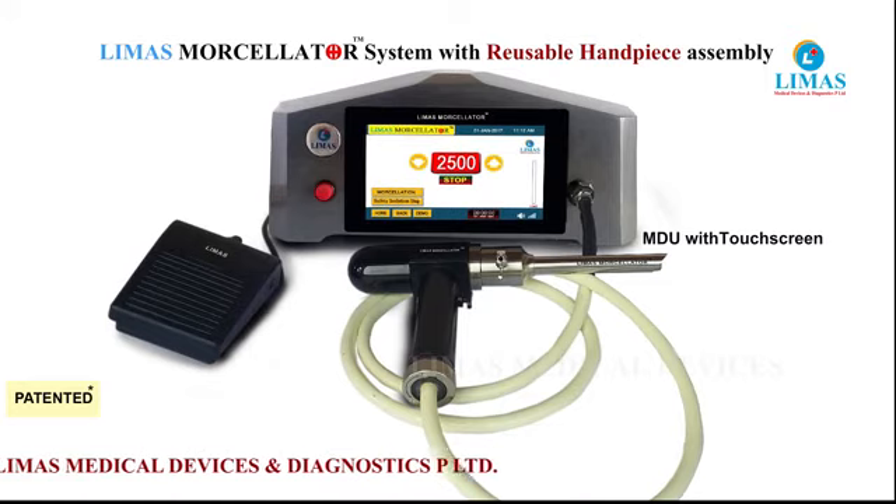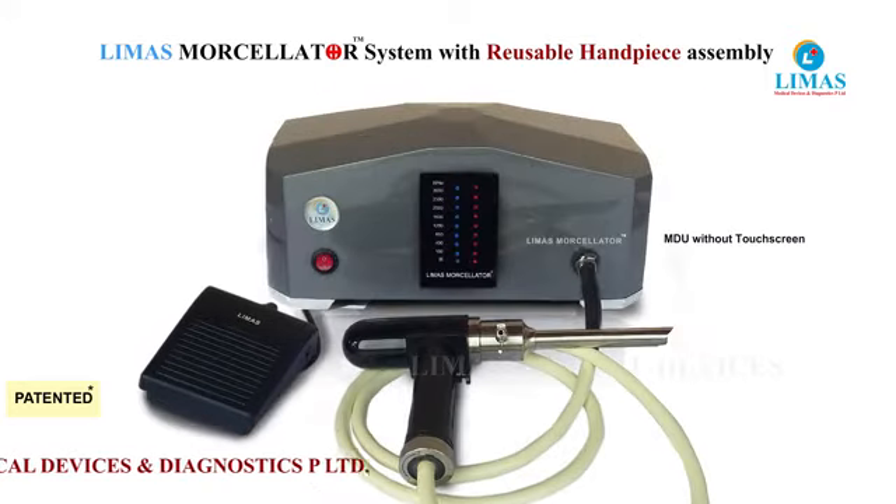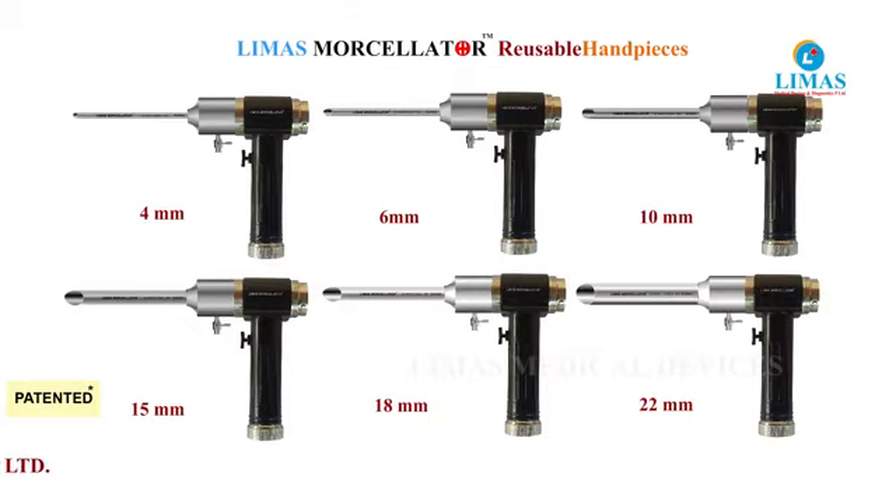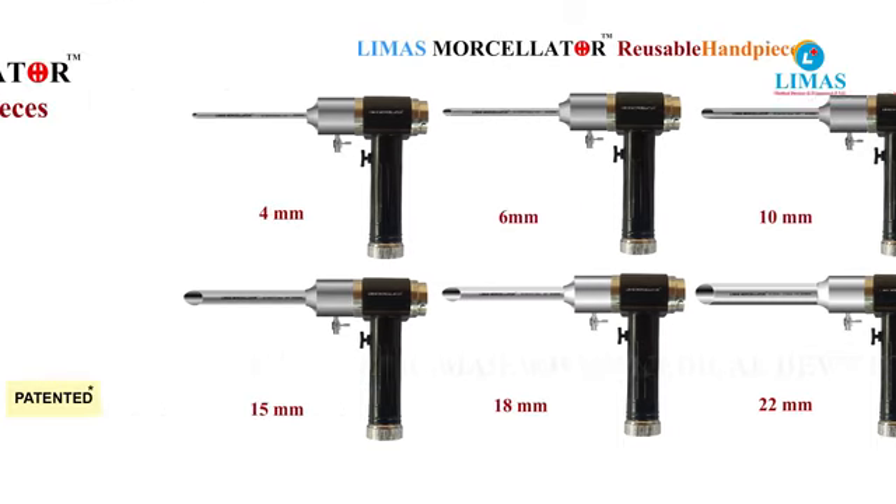Limas Morcellator has MDUs with or without touchscreen, and reusable and disposable hand pieces of 4 mm, 6 mm, 10 mm, 15 mm, 18 mm, and 22 mm.